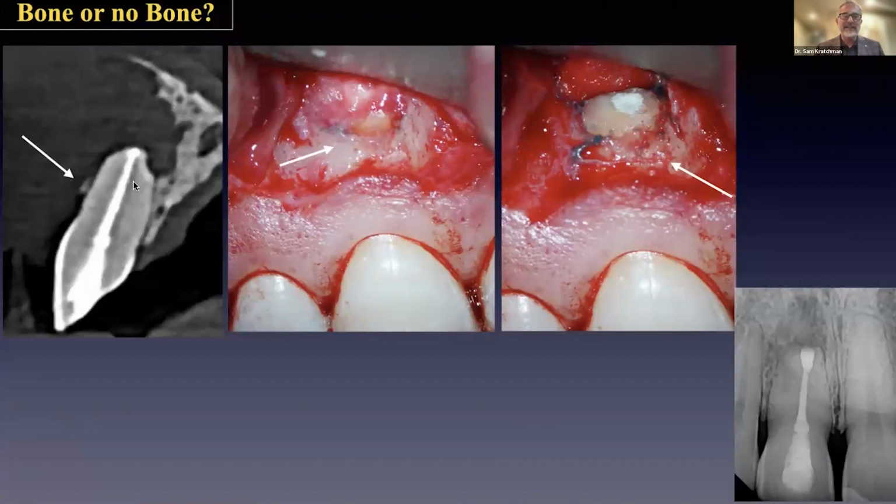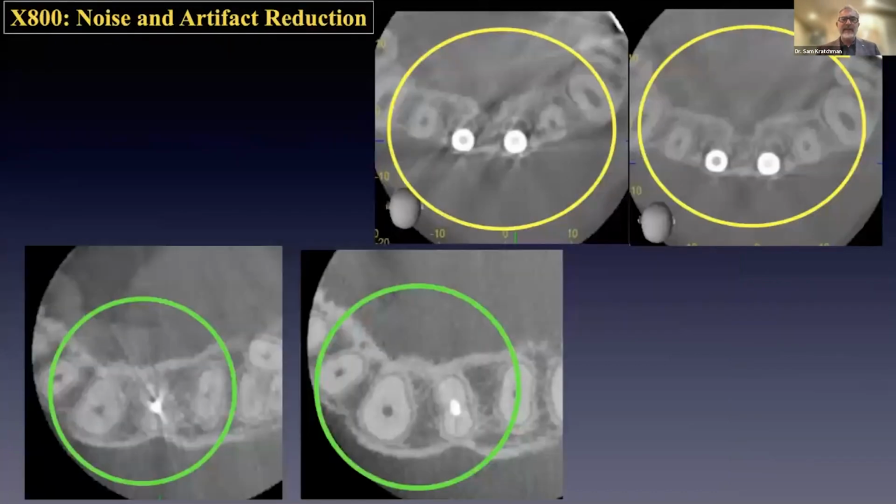And I'm like, wow, this is going to be a difficult case for me to deal with. This is more of like an endo-perio case. And then I did my submarginal incision, and this is all bone, right? This became a very routine, easy case. So what's the story with why this looks like this completely bone denuded? Here is the periapical lesion, when in fact there was a lot of bone there, okay?